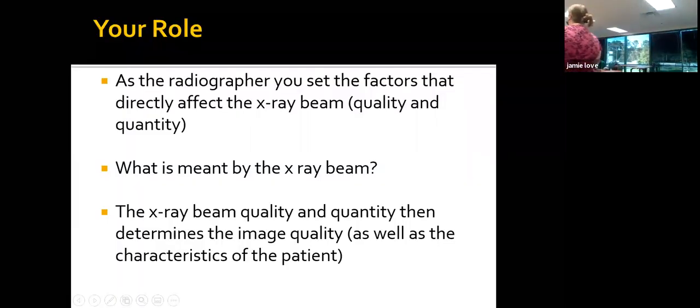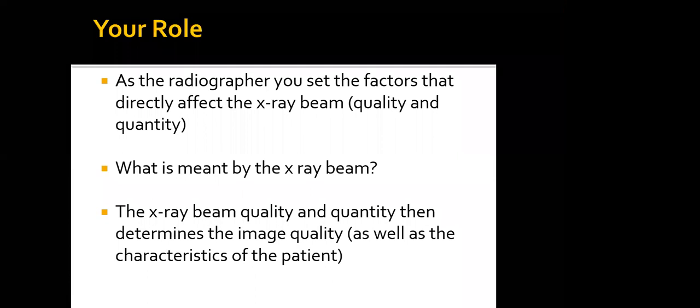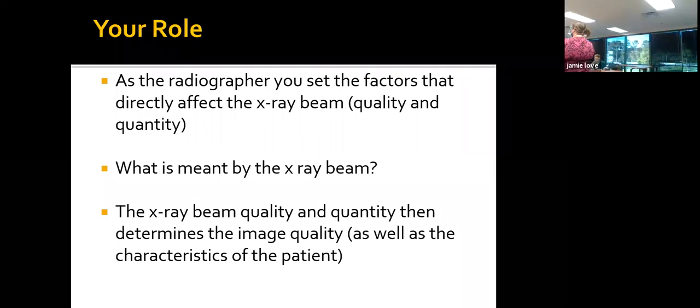was going into the computer settings. So what we set on one side is kVp, on the other side is mAs. mAs is mA, which is our milliamps, and seconds. So together that makes mAs. We just kind of call it mass. We don't say out mAs every time.